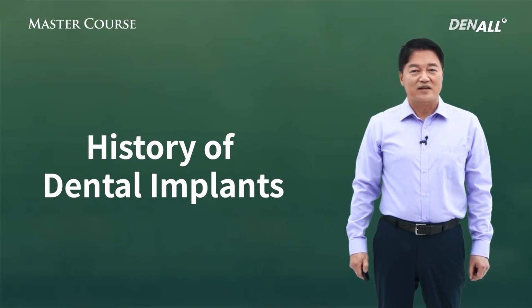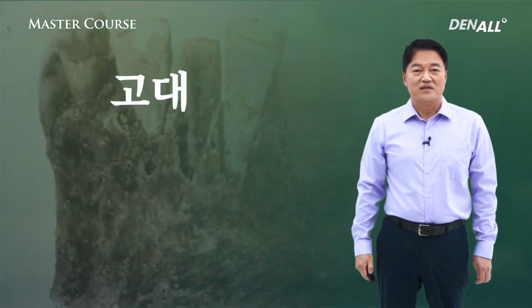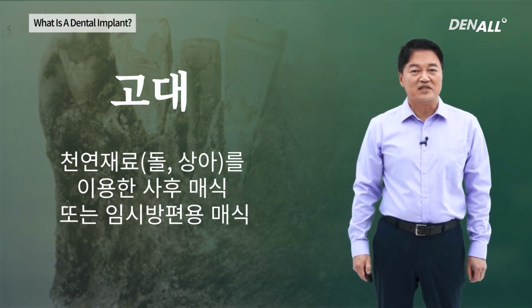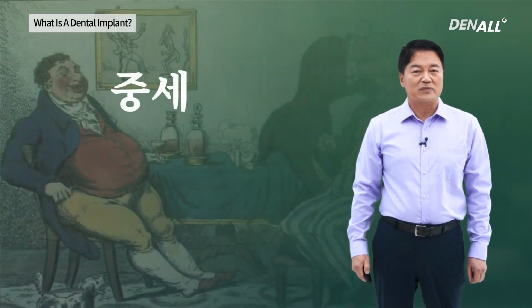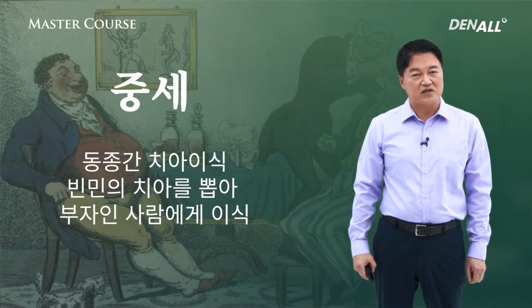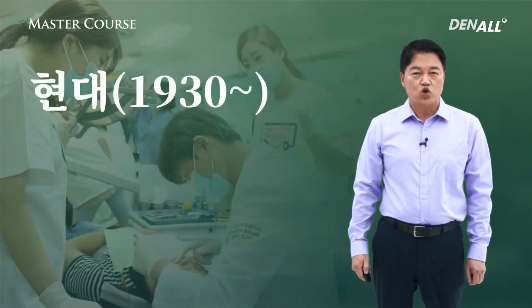History of dental implants. Let's look at them briefly. In the ancient days, rock and ivory was used, for the dead or as a temporary measure. In the medieval days, it's kind of funny, but tooth from another person was used. In other words, a tooth of a poor person would be taken out and transplanted onto the rich. In my opinion, I think it had very low success rate.